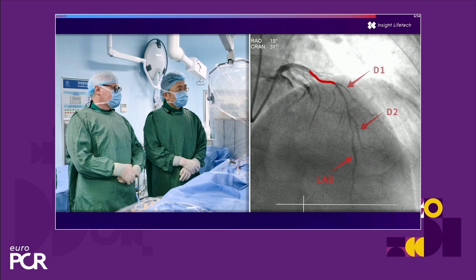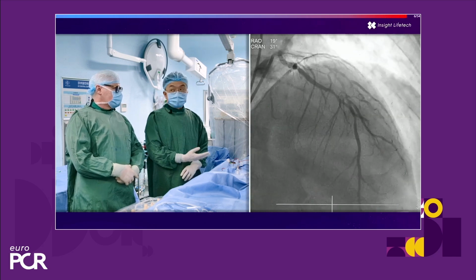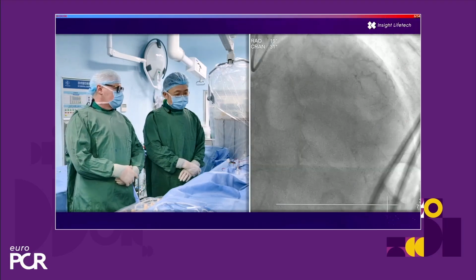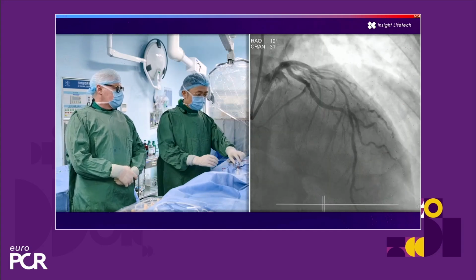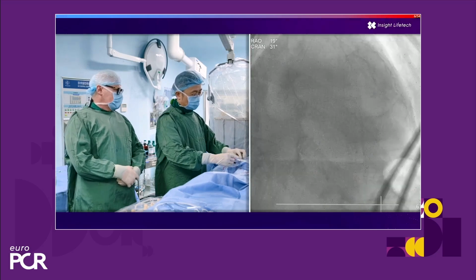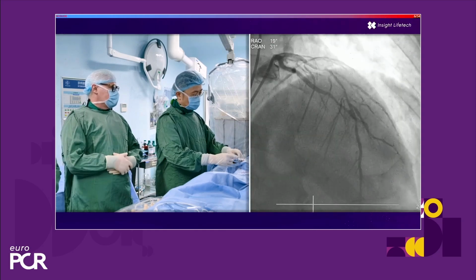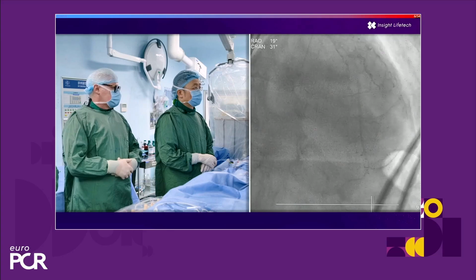So today our target is a long diffuse lesion in the left anterior descending artery. You can see the two diagonals we need to protect, and a very long diffuse lesion of this important vessel. So usually what will be your strategy for this kind of lesion in a young patient? We discussed this extensively, how to treat this patient, and our decision was first to do it with physiology and intravascular guidance to achieve as good a result as possible according to ischemia, but also to optimize our stenting procedure. So maybe we can go immediately for wiring of these vessels, and then we will start with physiology.